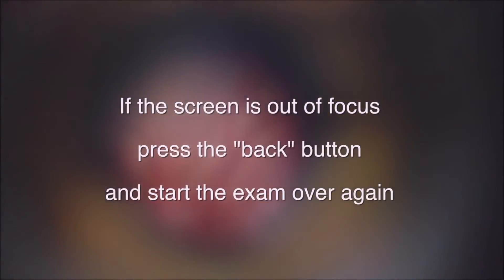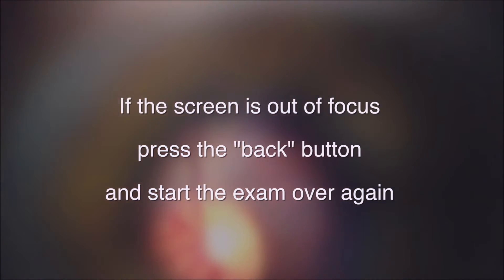Should you not wait long enough, you will notice right away when close to the pupil that the camera is out of focus. If the screen is out of focus, press the back button and start the exam over again. In the early stages of learning how to take scans of an undilated eye, you need practice before attempting to record videos.